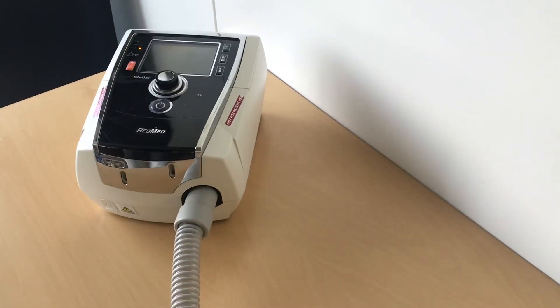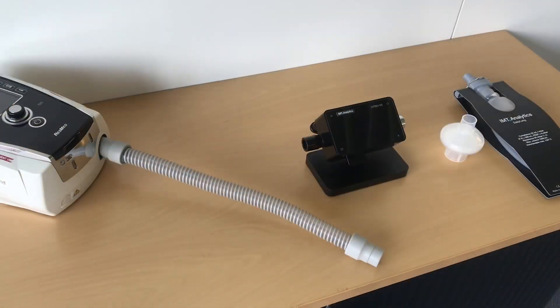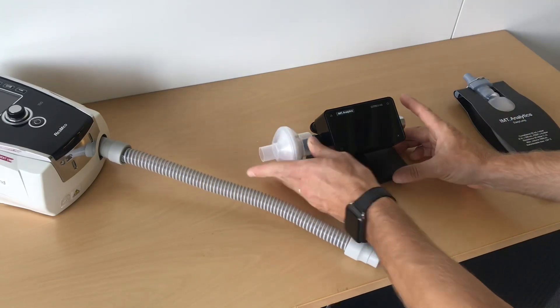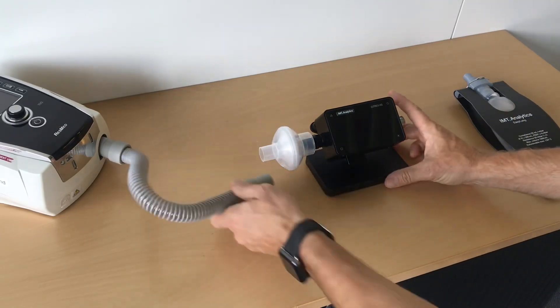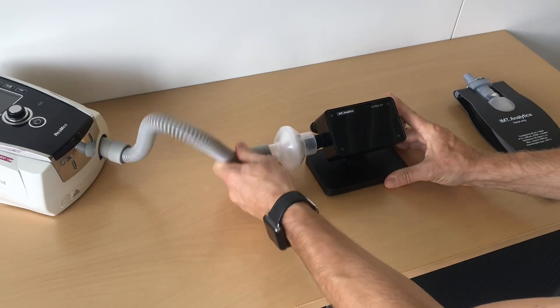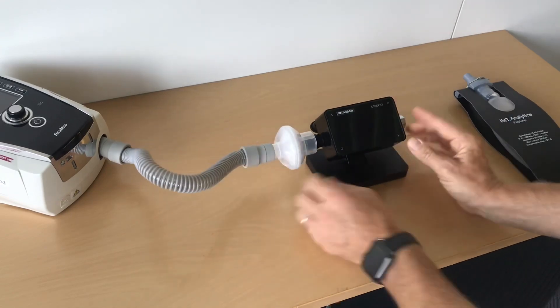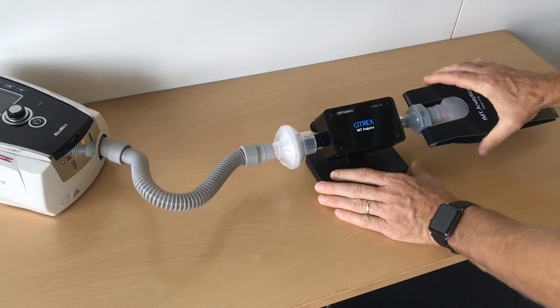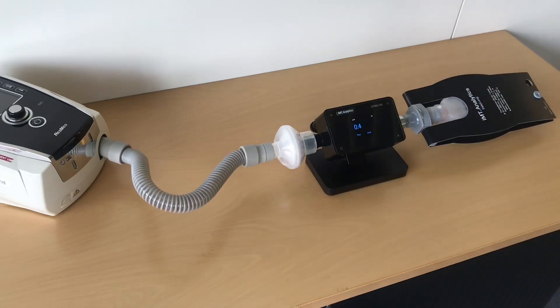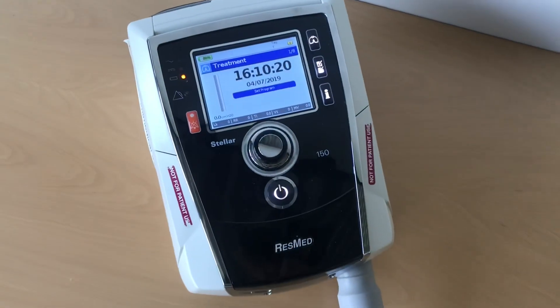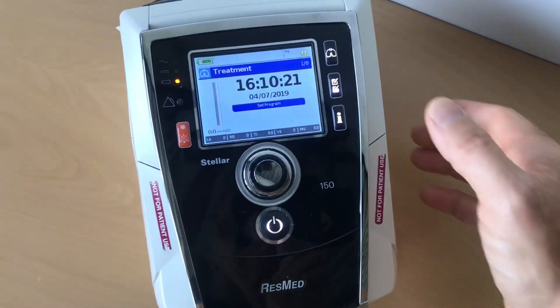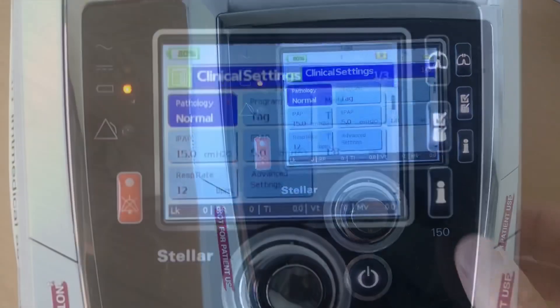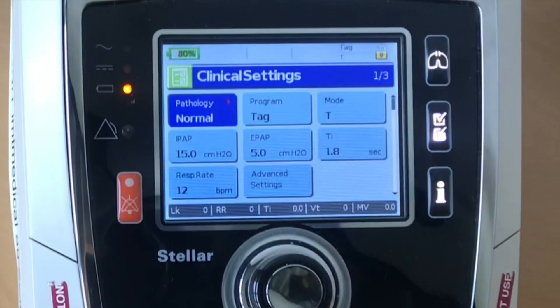To do that, you connect the tube to the ventilator on one side and on the other side to the Citrex analyzer. Then of course you have to use a test lung — in this case it's an easy lung. You switch on the devices and you will check the settings of the ventilator.